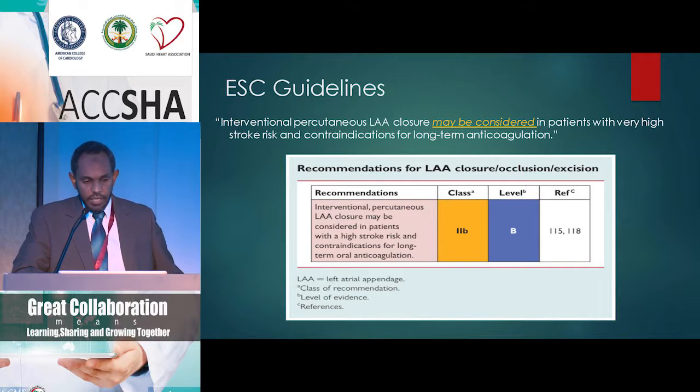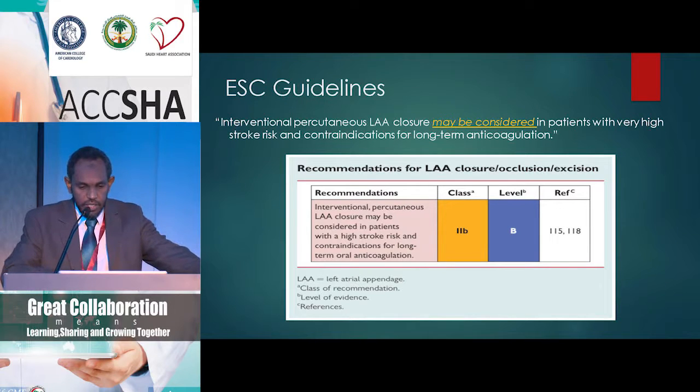Now, the current guidelines, ESC and ACC/AHA guidelines, both give this device technology a class 2B indication with a level of evidence B. So basically it can be considered as a modality of treatment.